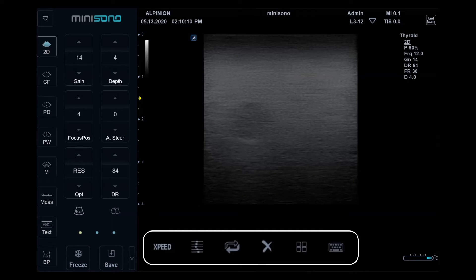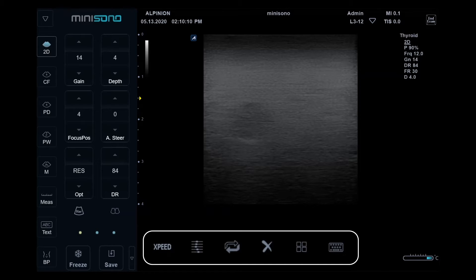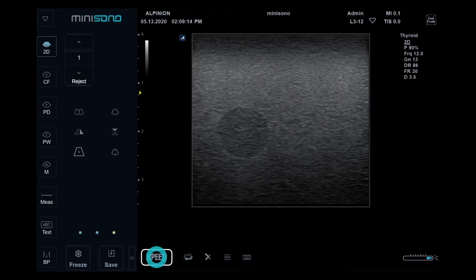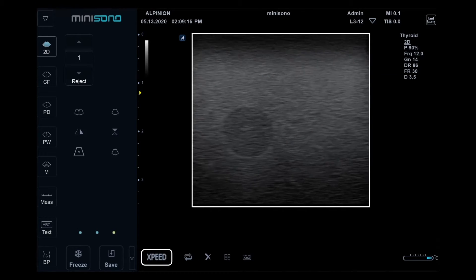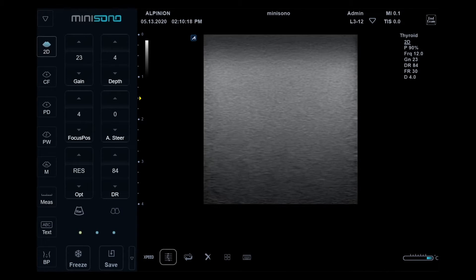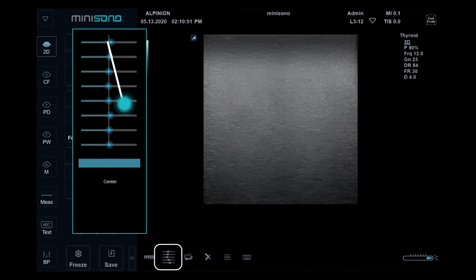On the bottom, there are XPED, TGC Slide, Initial, Clear, Clipboard, and Virtual Keyboard icons. XPED is an auto-image optimizing feature. To adjust TGC, tap the button and draw a line.